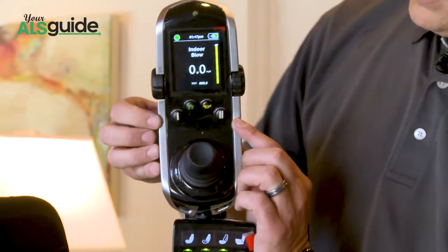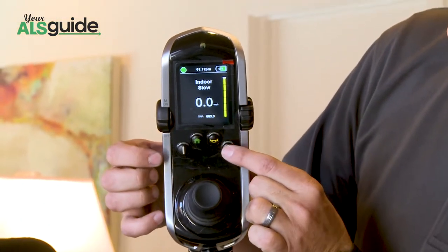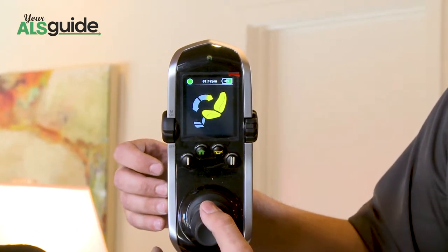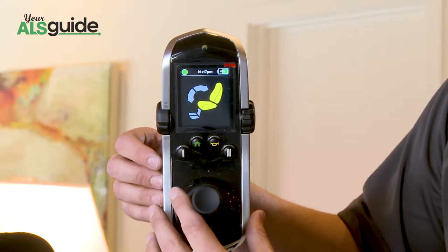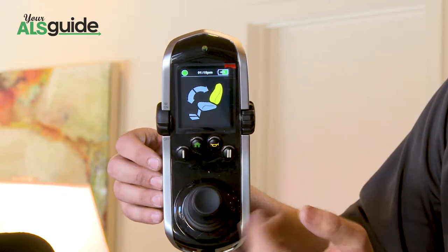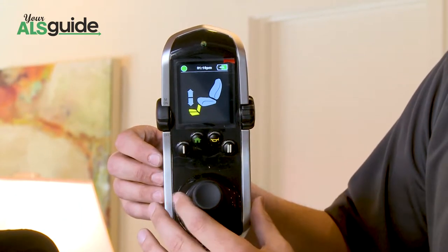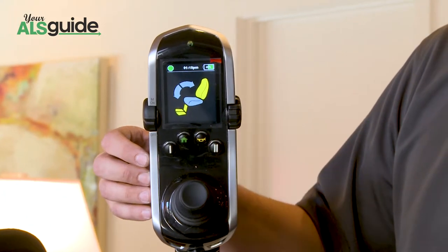Additionally, we have some shortcuts here. So there's a key one and a key two. This shortcut, key two, takes you to your seating. So you can utilize by pulling back. This is your tilt. And you can kind of scroll through the different seating functions. That's your recline. And you would just pull or push to come in and out of the recline. That's your seat elevate. That's your power legs. And you also have the option to do seat and legs together.